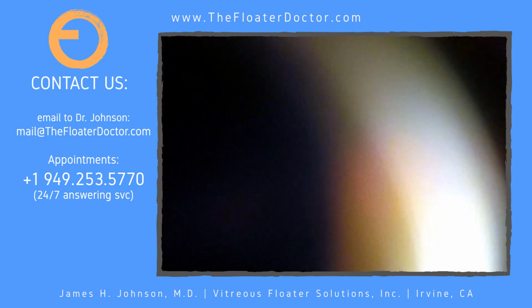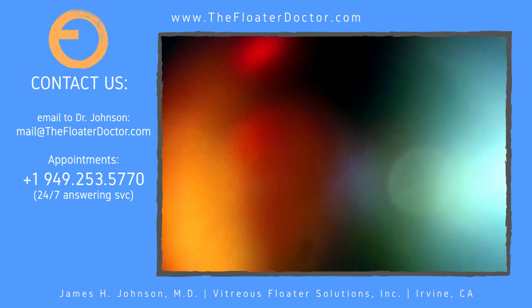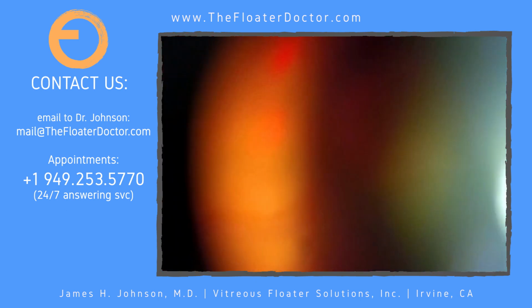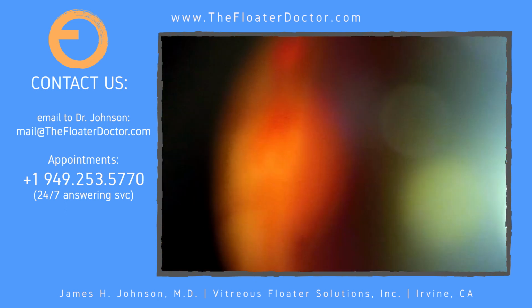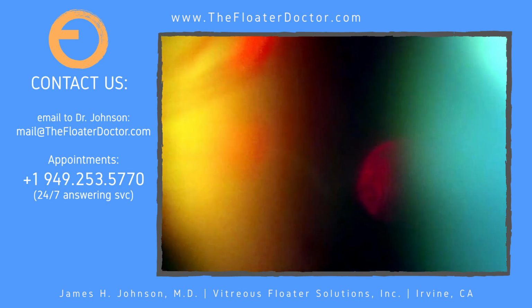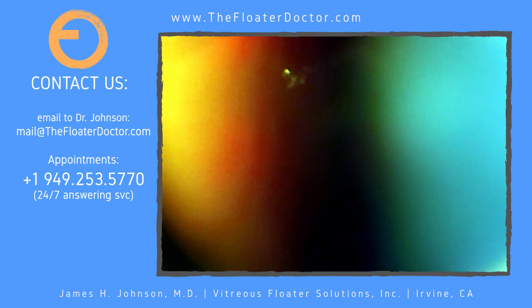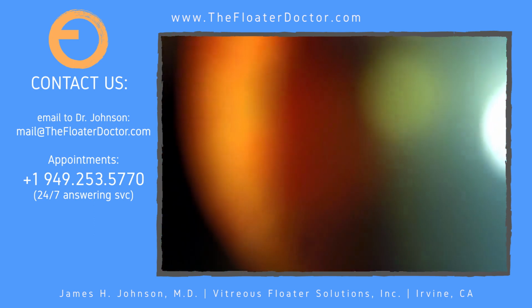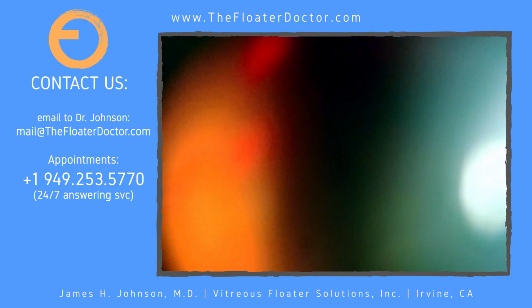To your far right this time, and then back to light. Yeah, that didn't really help. Let's do that again. Look down, back to light here.